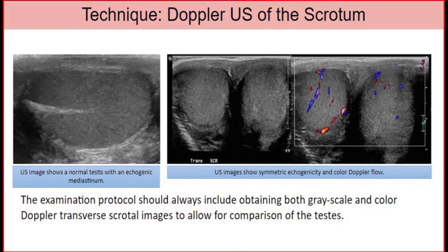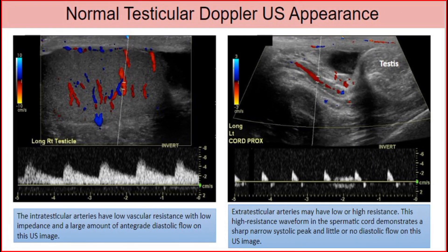The picture on the left is an ultrasound image showing a normal testis with an echogenic mediastinum. The picture on the right is an ultrasound image showing symmetric echogenicity and color Doppler flow. The examination protocol should always include obtaining both grayscale and color Doppler transverse scrotal images to allow for comparison of the testes. The intra-testicular arteries have low vascular resistance with low impedance and a large amount of antegrade diastolic flow. The extra-testicular arteries may have low or high resistance; this high-resistance waveform in the spermatic cord demonstrates a sharp narrow systolic peak and little or no diastolic flow.